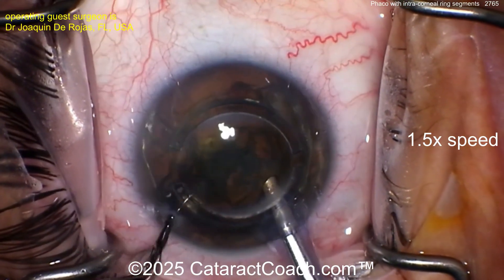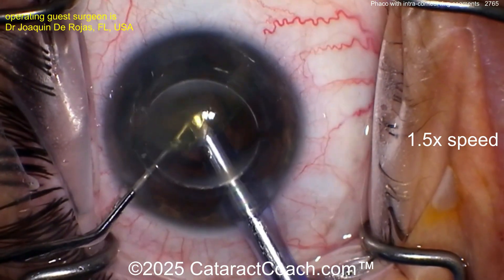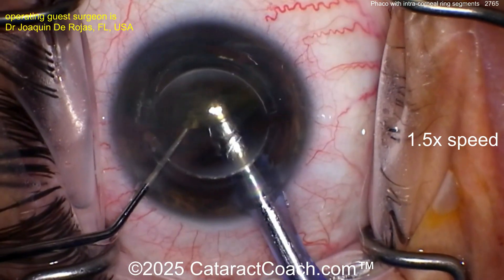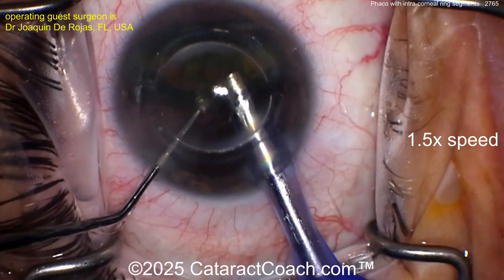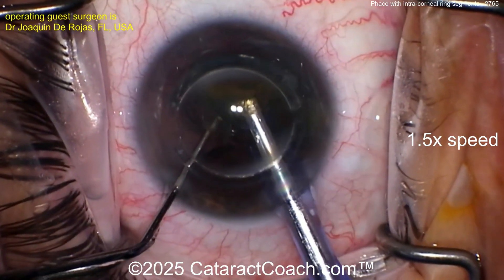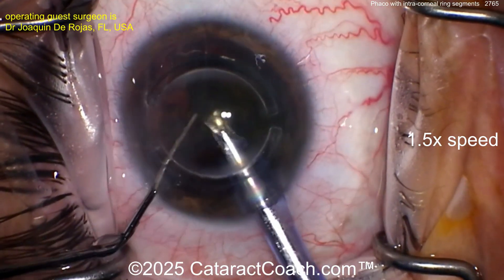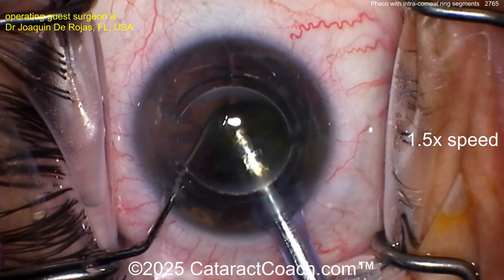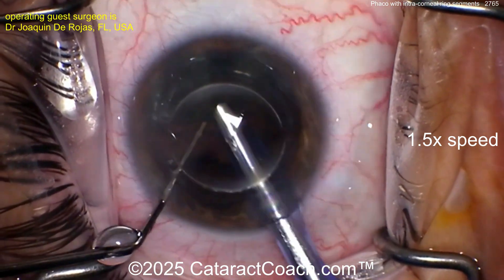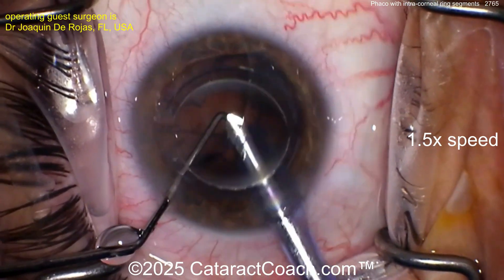The nucleus is not very dense. Going in with the phaco probe and the chopper — let's see the technique. We're doing a kind of tilt and tumble, as Dick Lindstrom has described and featured on Cataract Coach. If you don't know the technique, go to cataractcoach.com and type in the keyword 'tumble.' Look at that: efficiently removing the nucleus in a very safe manner with minimal phaco energy.